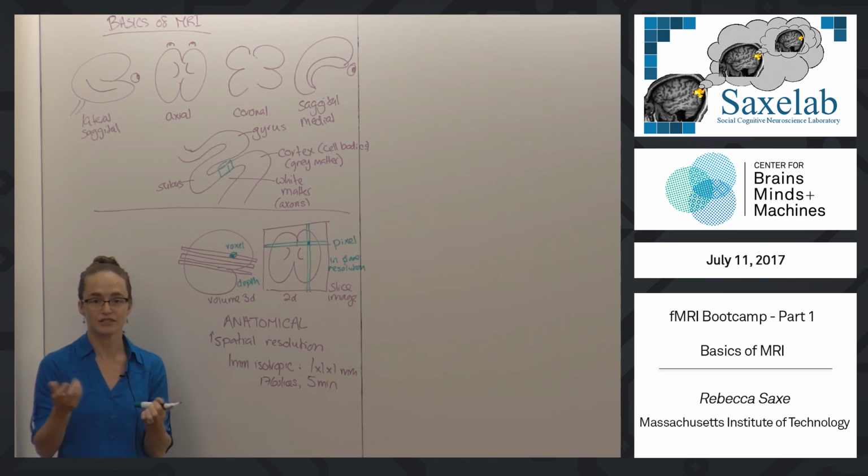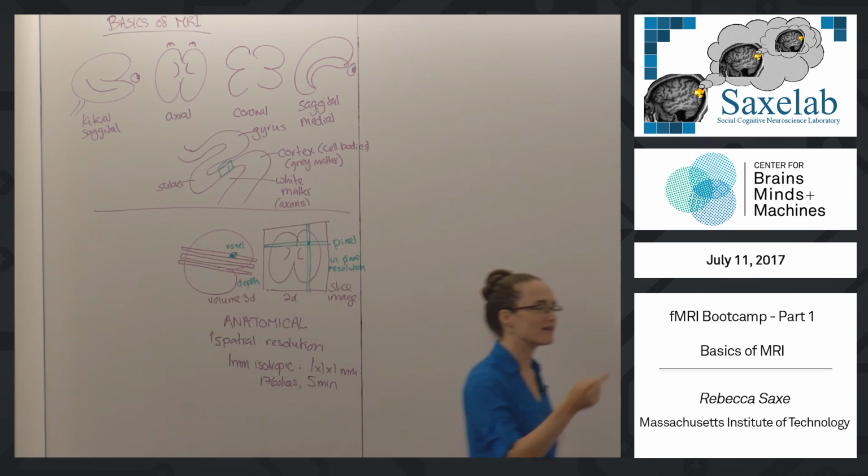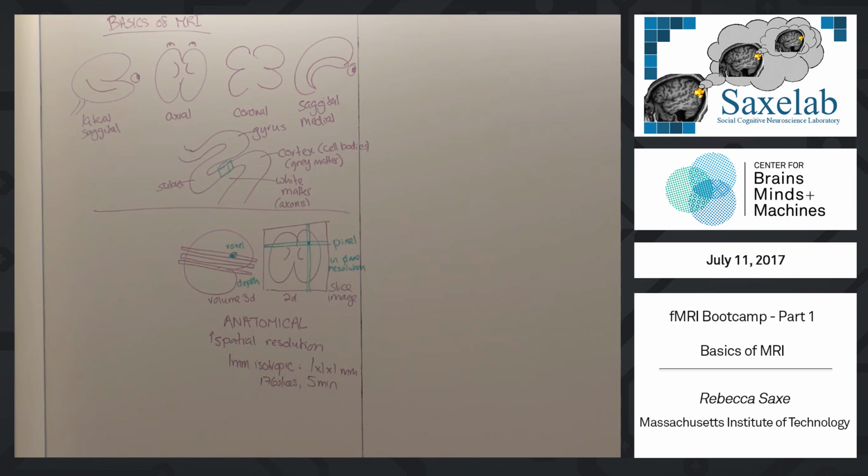With a DTI image, it might take 20 minutes to get one picture of the brain. These parameters change fast, so I don't know what they are right now. I will get more into DTI later if you like, but in a DTI image, you're taking a picture of each voxel at each diffusion direction, and so you have to take many pictures of every slice.